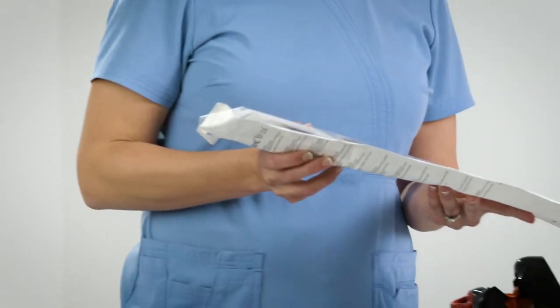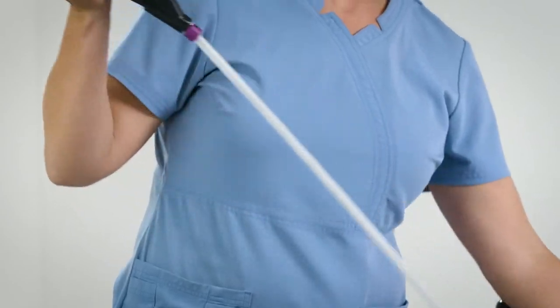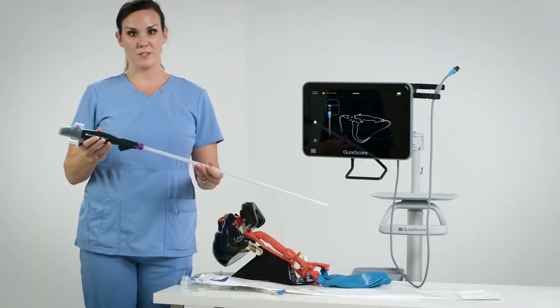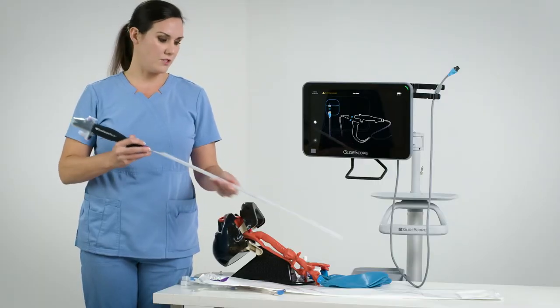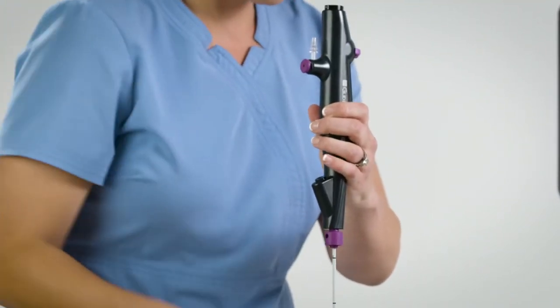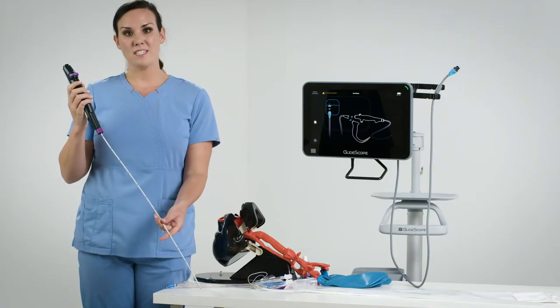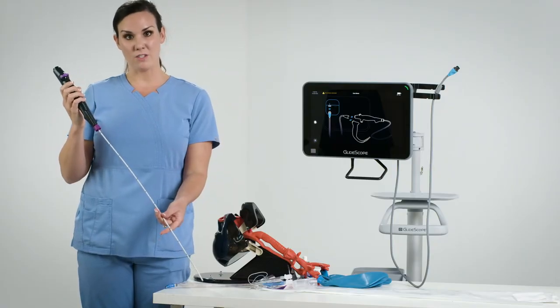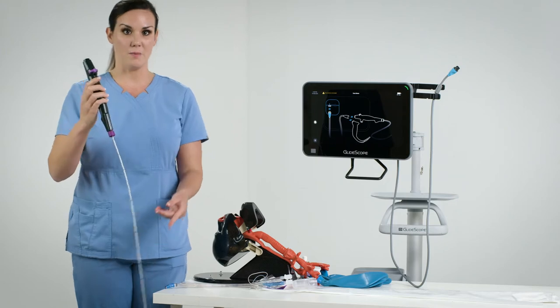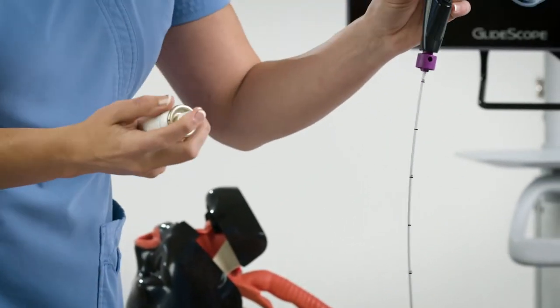I'm now going to remove the B-Flex 3.8 millimeter scope from its packaging. All B-Flex scopes come with two protective sheets, one over the insertion tube and one at the top of the scope. You need to keep the insertion tube as straight as possible when using the B-Flex. Before I intubate any tube, I want to make sure that the insertion tube of the B-Flex is lubricated properly. I like to just use some lubrication spray.